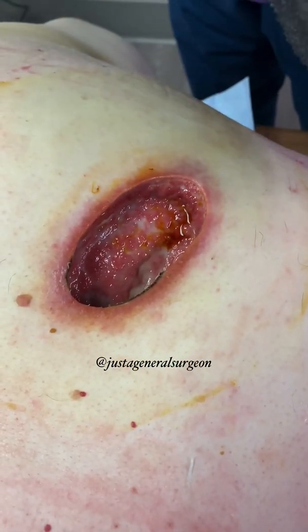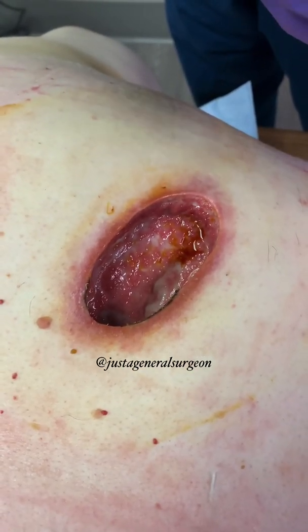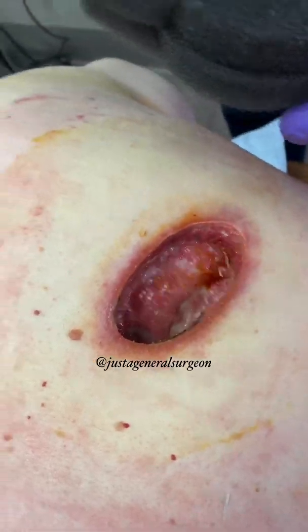This is the wound we have after removing an infected cyst on this gentleman's back. He's been doing wet-to-dry dressing changes until we got this wound ready.